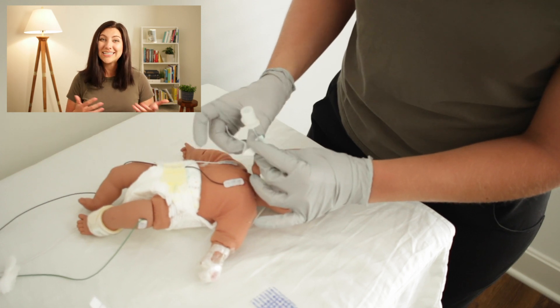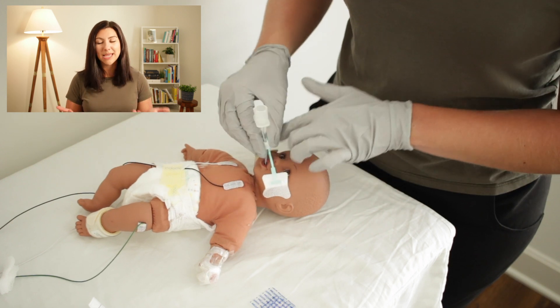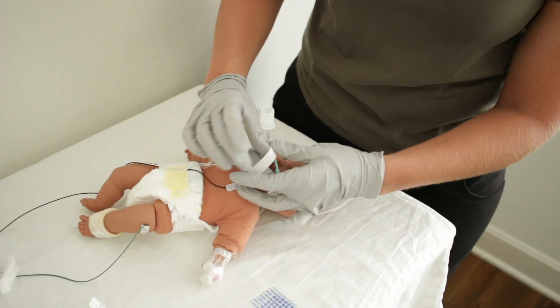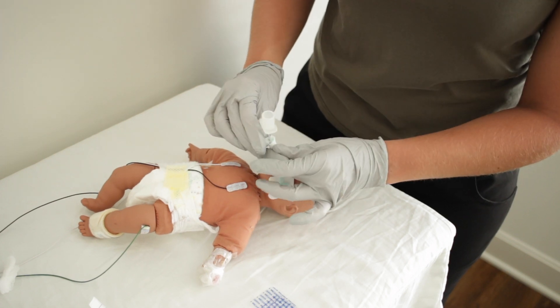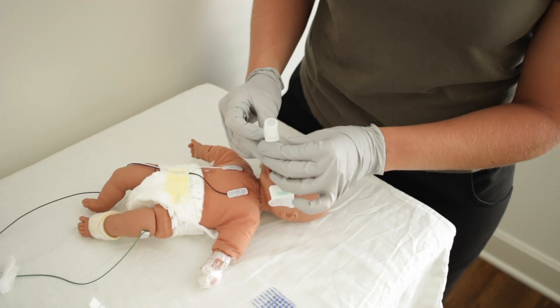This also makes it a lot easier to advance or pull back the tube when confirming its depth with an x-ray. After you've wrapped the tape around the tube and the neobar platform once, typically everyone will remove their hands to see how much play is in the neobar. Sometimes you're holding the tube so firmly that the neobar can be putting quite a bit of pressure on the patient's lips. Conversely, the neobar could be too far out, putting unnecessary outward tension on your tube. If all looks well, you can then proceed to taping the tube the rest of the way.